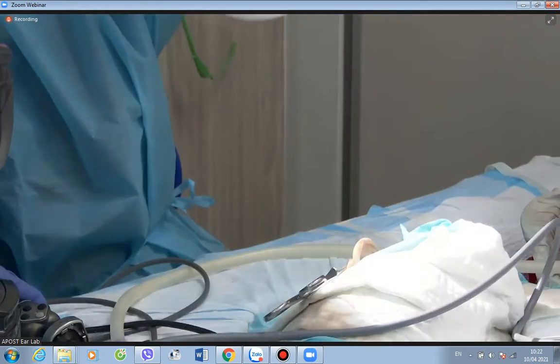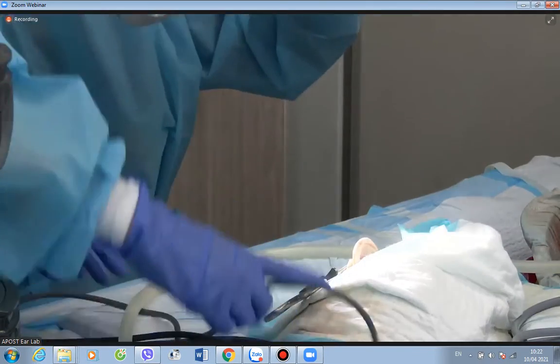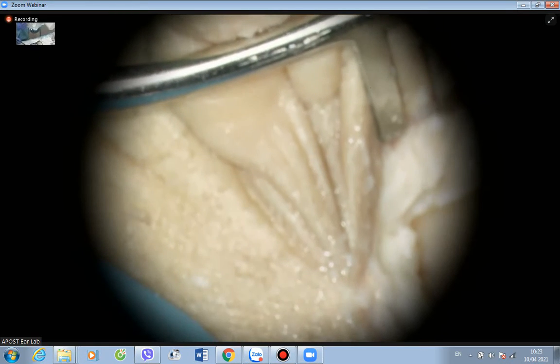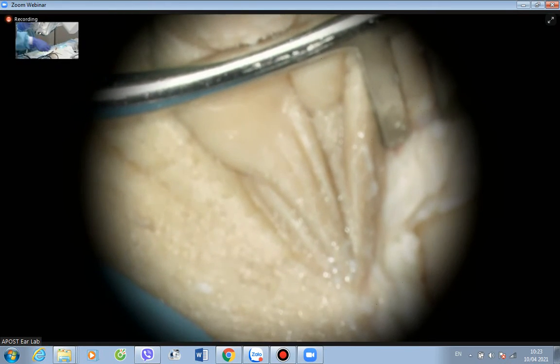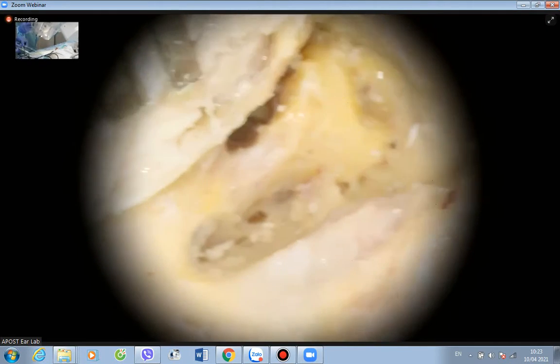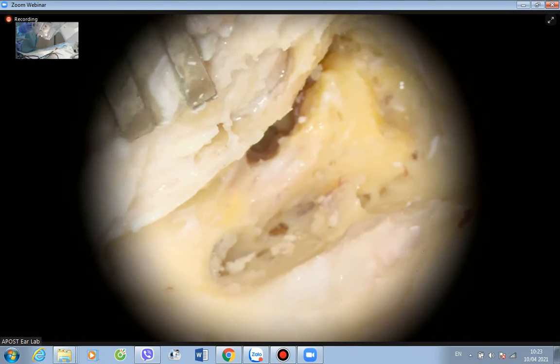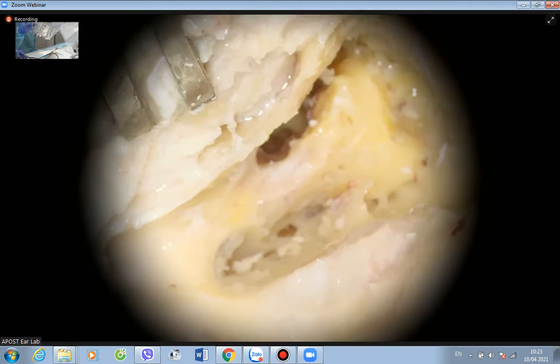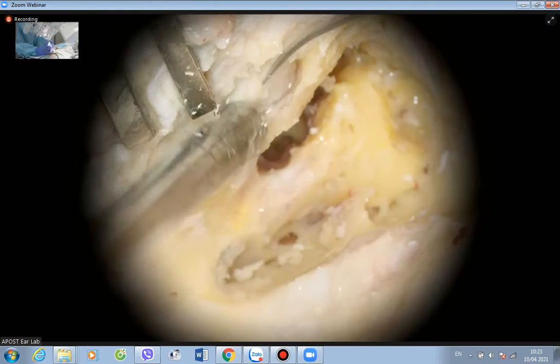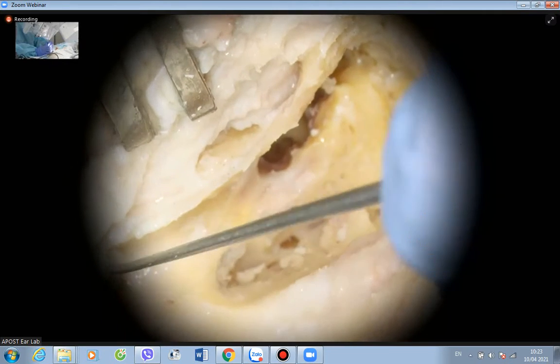So some of us will have examination with temporal bone examination, or some of you during the operations, you might be doing a revision operation, and you might be receiving some others previous dissection, like from this. So you always identify yourself with your landmarks. So this is what you can see, the posterior canal wall, and this is the mastoid tip.